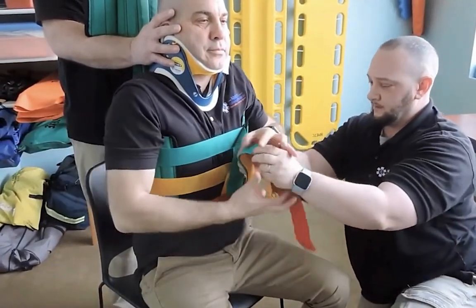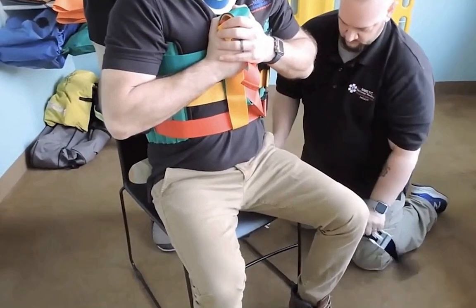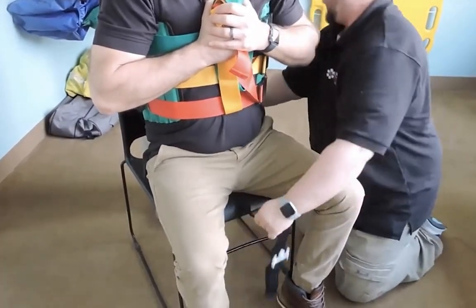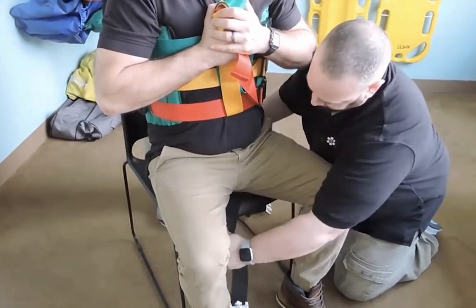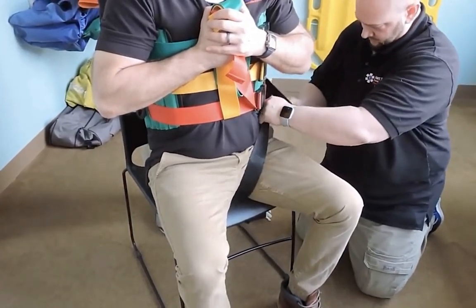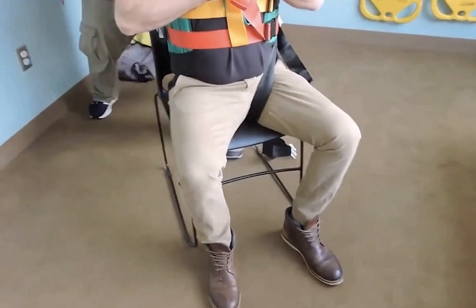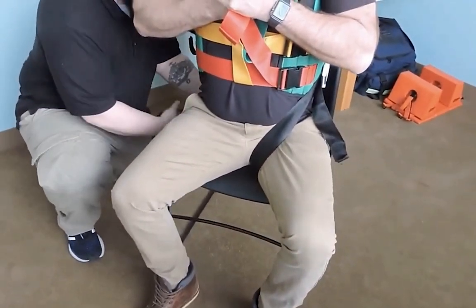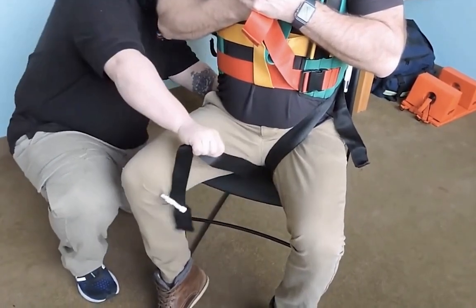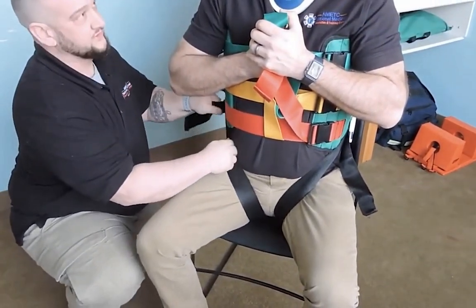Sir, do me a favor — would you hold these for me? All right, I'm going to work on the leg straps. These are just going to come under your leg and secure up under the leg. We're going to make sure these are straight down in the back, using the seesaw method so as not to grossly manipulate the patient. Make sure these are up high. I'm going to secure the leg strap. You okay there, sir? All right. Same thing on this side — going straight down, feeding it under the leg with our seesaw method, so as to not grossly manipulate the patient. You okay on this side, sir? Mm-hmm. All right.